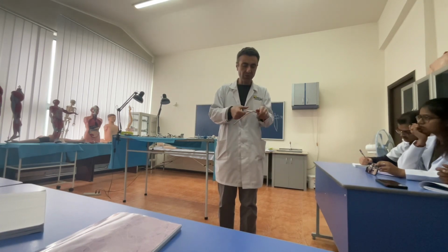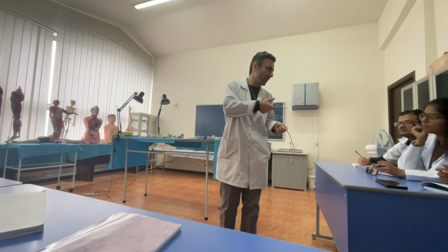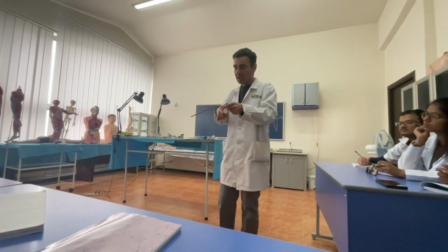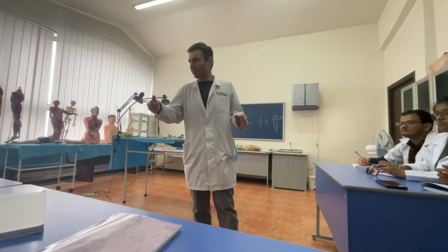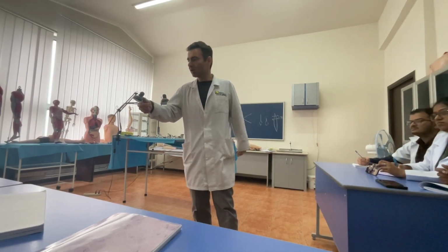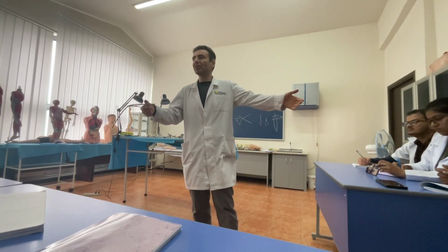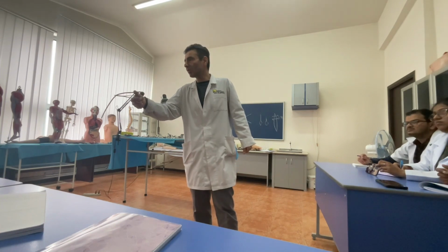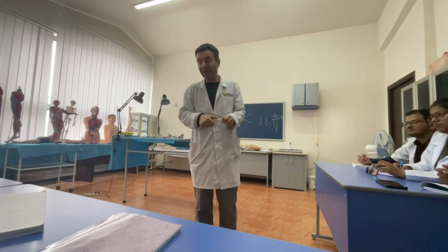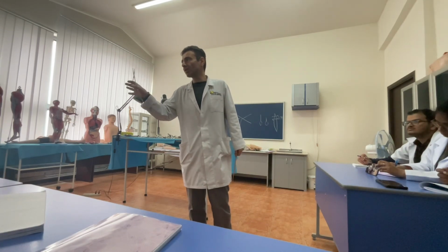If you apply it on the wall of the vessel, you will cause more bleeding because it will perforate it. Let's say if the neighboring structure is not so delicate and you need to hold, to make a strong fixation, you use this kind of instrument. But if near your artery, for example, there is a vein, of course you will not use it because you will perforate the wall of it. Anyhow, remember please, this is for gripping of the tissues.